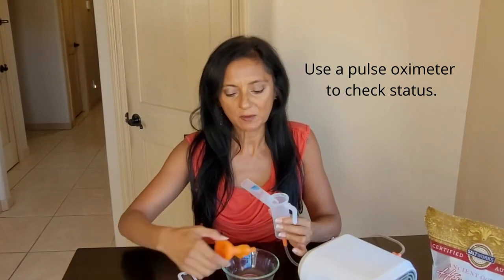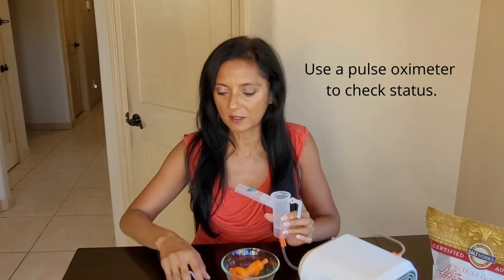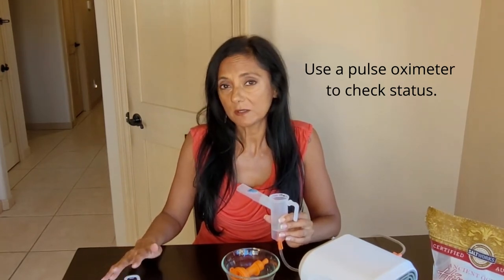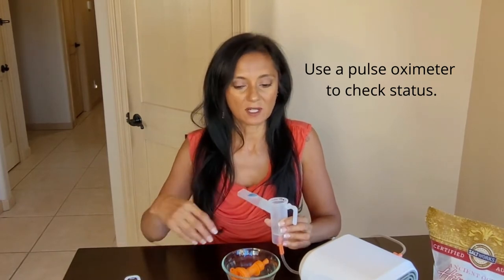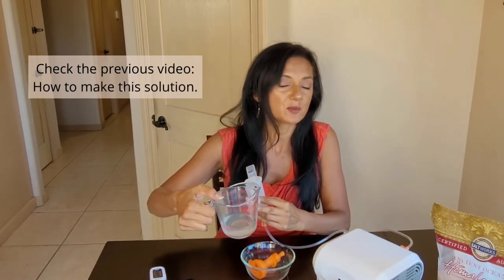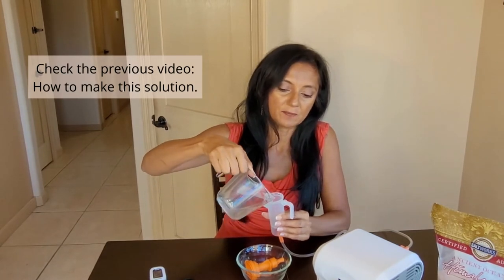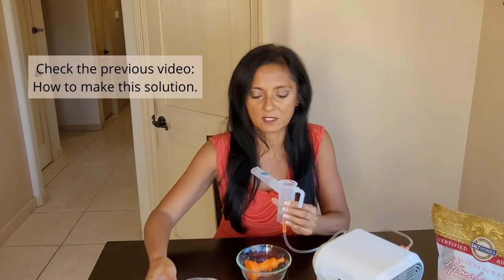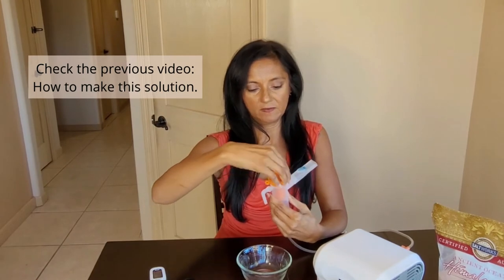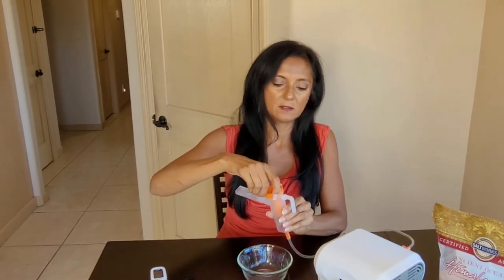So I'm getting ready to show you how to breathe through your nebulizer. I've got the setup right here. What I recommend is you check your pulse ox with a pulse oximeter. You can check before you do your nebulization, and during and after, and watch the saturation increase — because it should as you're getting more air into your airways. So you fill this up with your solution. I've mixed a food-grade hydrogen peroxide with saline. I'm going to do just about 4 to 6 ml. Put your insert in and lock it in.